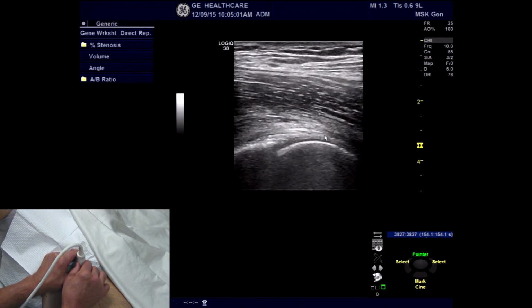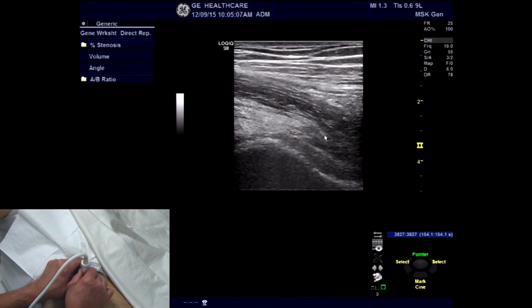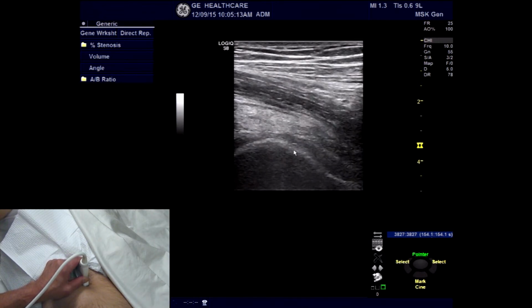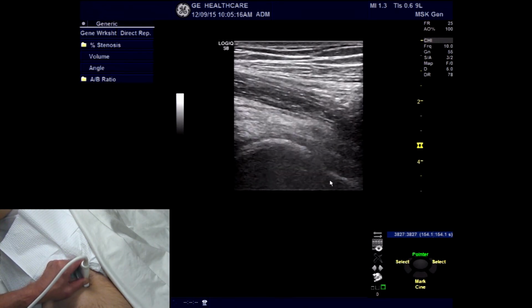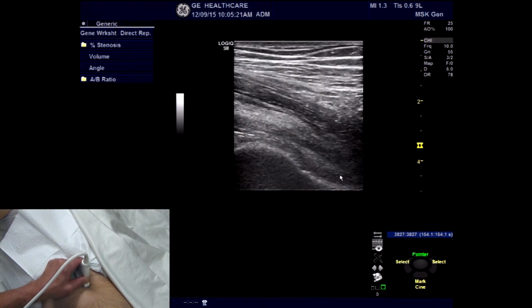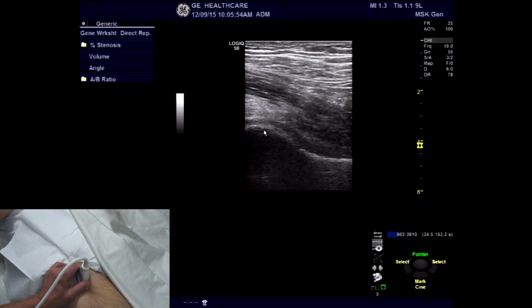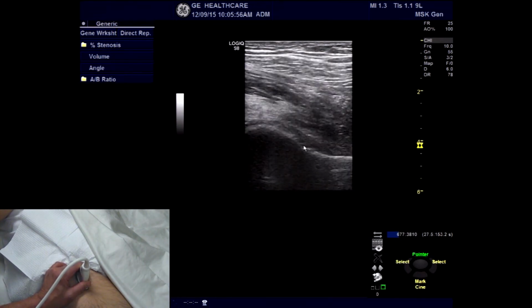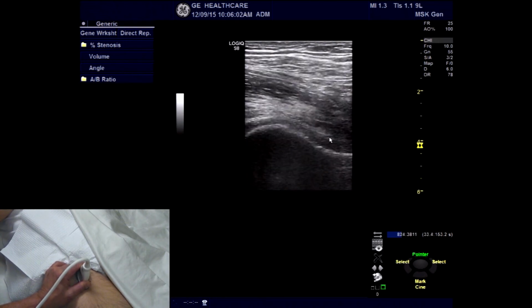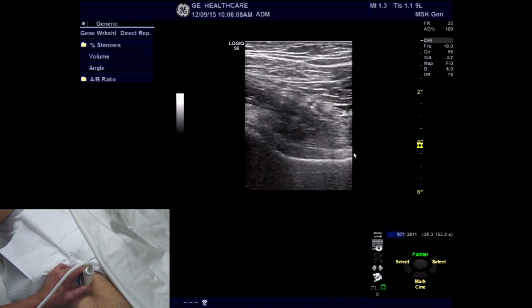Sliding the transducer inferior and lateral, we're going to get to the area of the femoral head-neck junction, which is this structure on the screen right here. You'll see the femoral head, the femoral neck, and then just superficial to that, you're going to see the area of the anterior capsule of the hip as it comes down. Now, once we get into the area of the femoral head-neck junction, and you're going to see a bit of the shaft of the femur here, you're going to see a bright capsule appearance of the anterior capsule of the hip as it comes down onto the insertion.